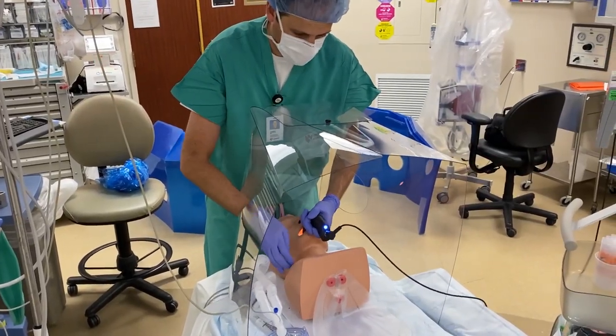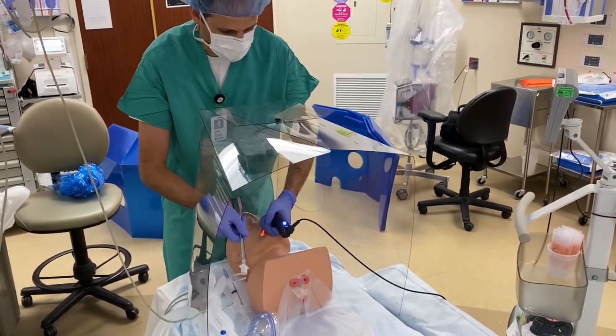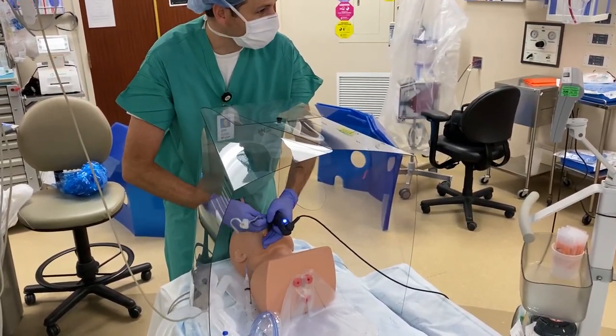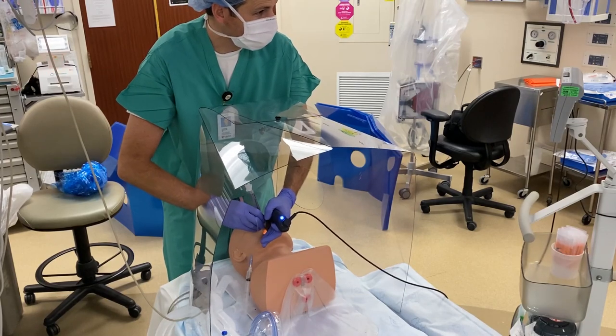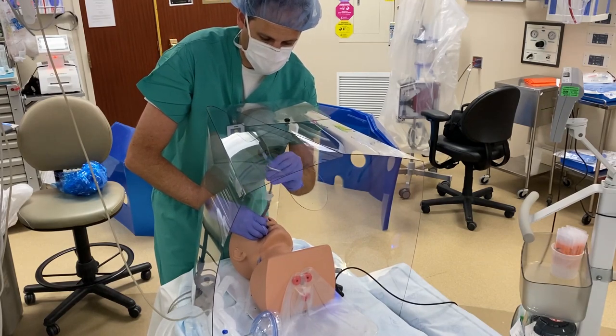We envision using these boxes not only during the COVID epidemic, but also for situations like tuberculosis, as well as during a bloody or trauma intubation.